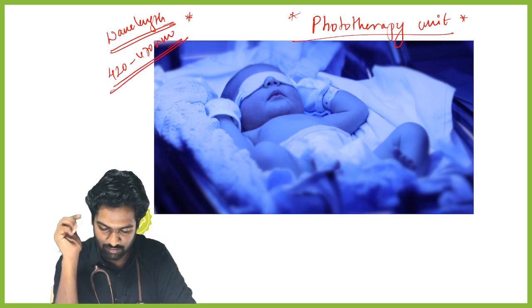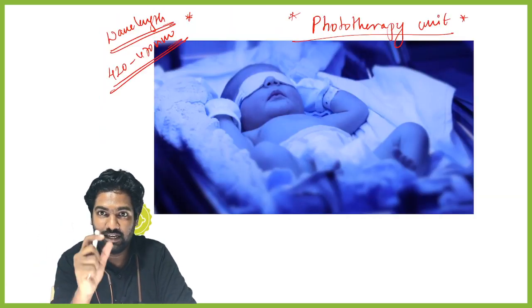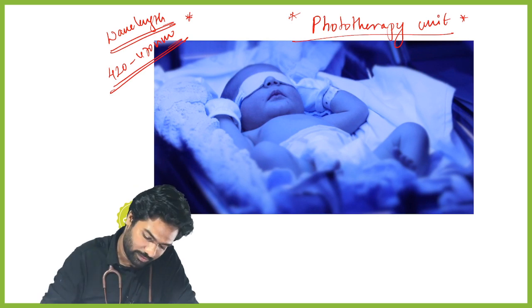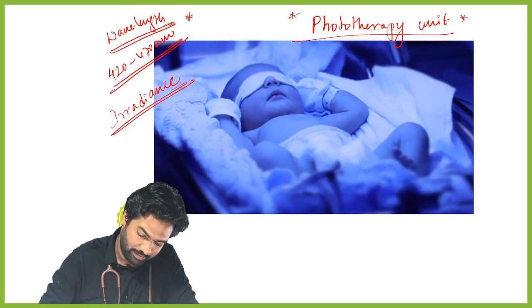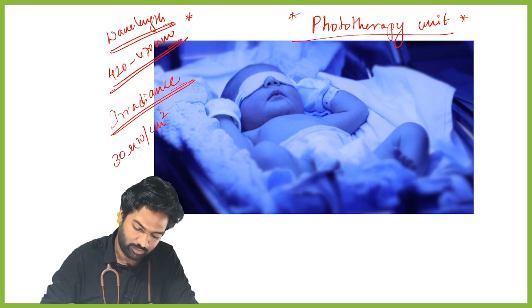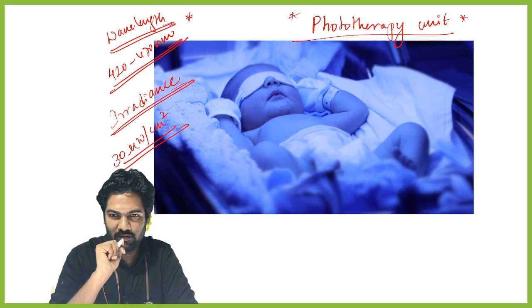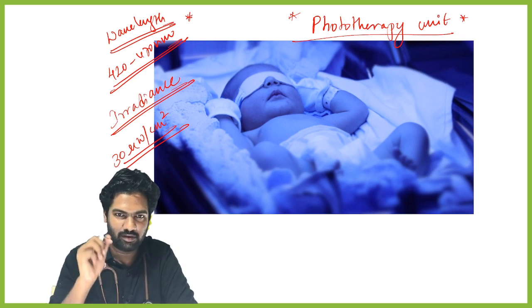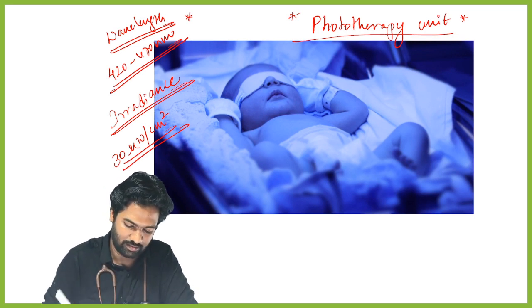Another, slightly higher-level question they have asked was what the irradiance is. Irradiance is different. It is 30 microwatt per centimeter square. They'll use a separate estimating machine, see multiple different points, and calculate this irradiance.